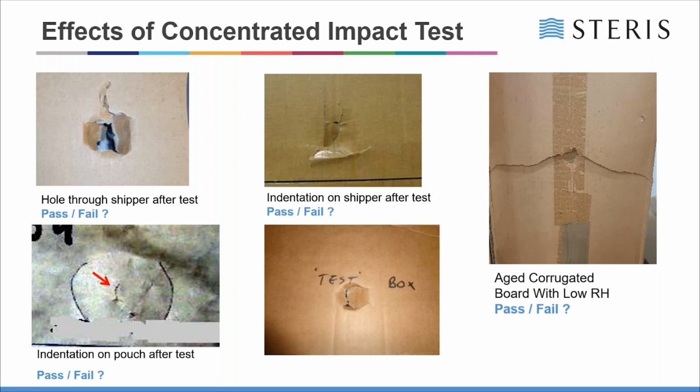The issue becomes a real issue where the weight that's dropped on it or swung into it goes through all the layers of the packaging and damages the primary layer or the primary package. But again, that's totally up to you to decide what that is and how that's accepted, and what your sterile barrier is. That's where it's very important to understand what your primary sterile barrier is.